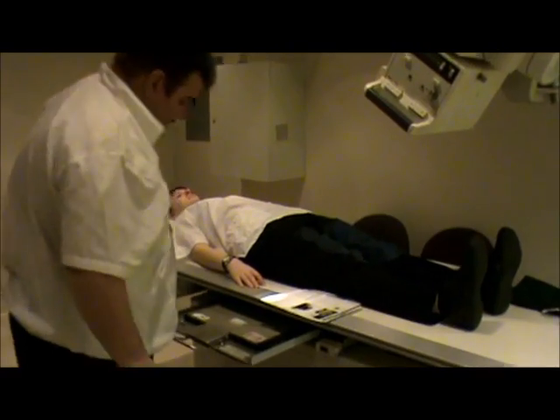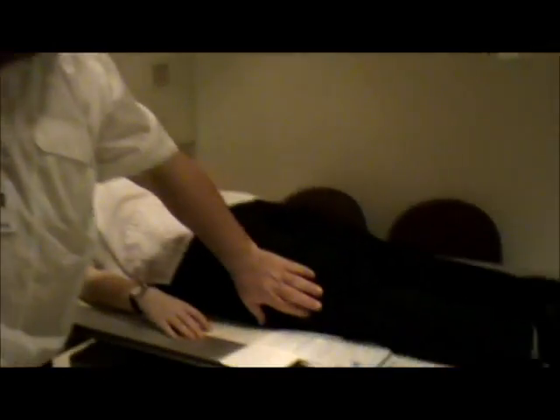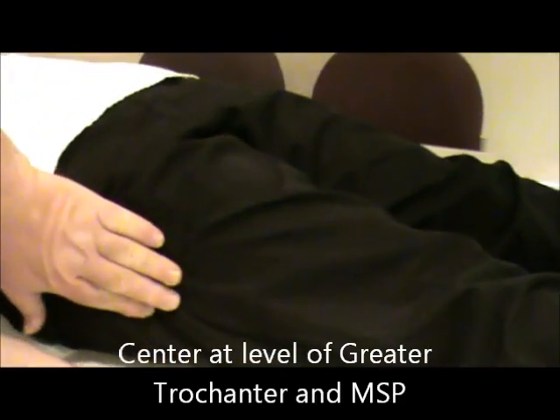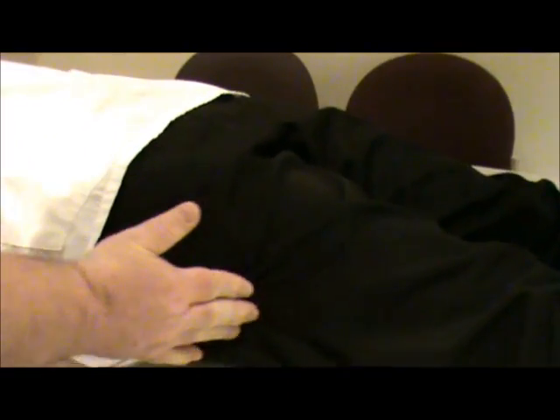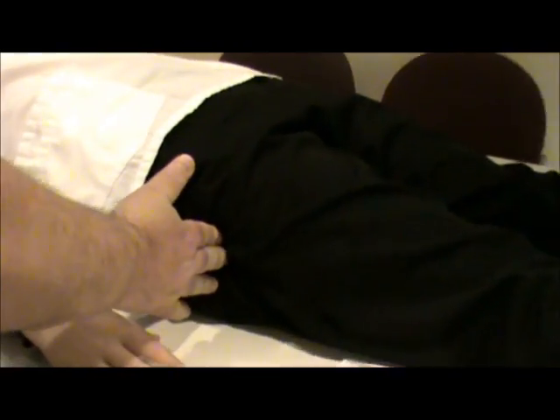Give it a center lock, center to the film, leave our marker on there. The centering for this one is going to be one to two inches below the surface of the pubis. Another way to check this is it's going to be about the level of the greater trochanter. An easy way to feel that is you come to the outside of the leg and start pushing on the leg — as you come out, the greater trochanter will protrude out more. It's soft, soft, and then you get to a point where it protrudes out, and that's the greater trochanter. That's the level we want to center at.